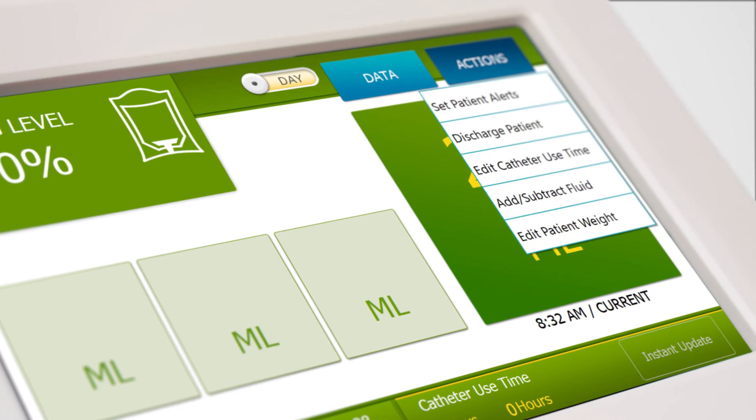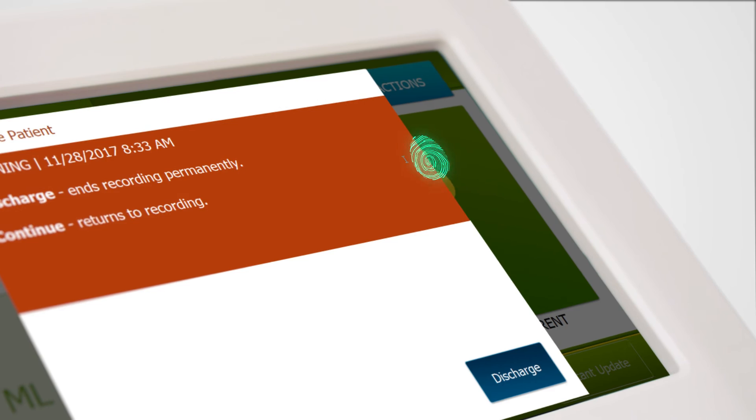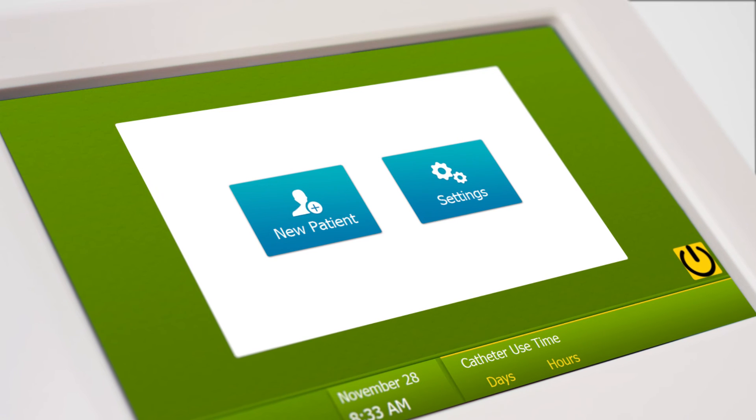Finally, once a patient no longer requires close urine output monitoring, simply touch discharge patient under the actions button to erase all the patient data in the system.